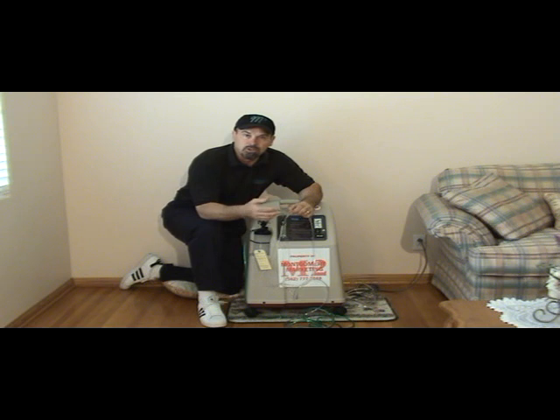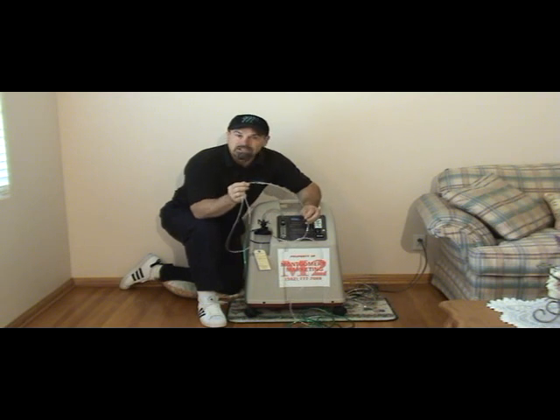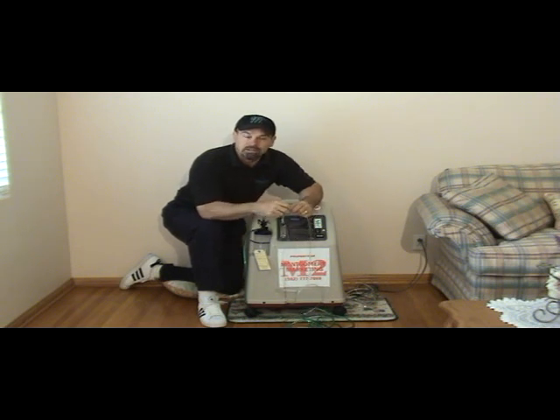Another issue with extended tubing is with humidification, if you're using that, the water is going to build up in the line of the extended tubing. There's no way to avoid it. The longer the tubing, the more water will build up. If you get in a situation where you notice there's a lot of water in the line, there are two options. One is to place another extended tubing along there and just hook it up the same way.